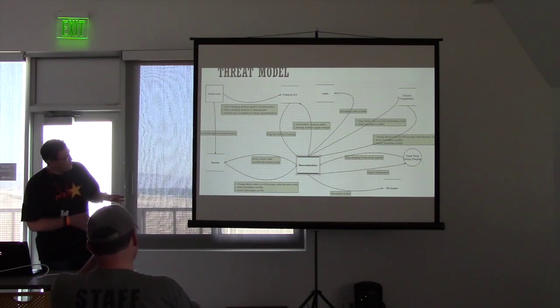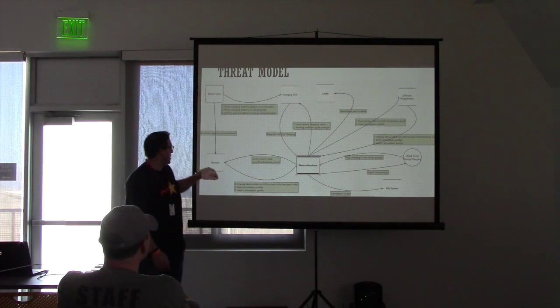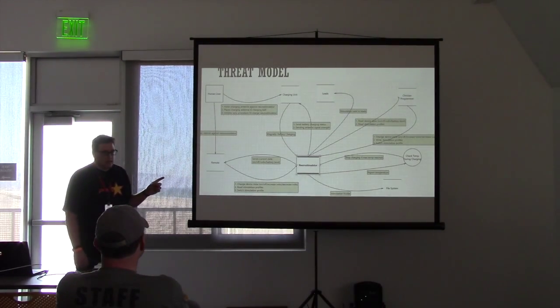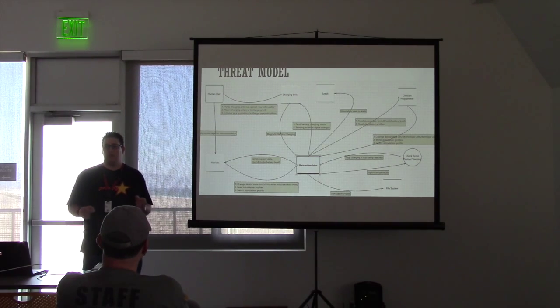A couple of the components here are kind of critical. The neurostimulator itself is the small device that was implanted in the back. You have a remote control, which is wireless communication on the 400 megahertz bandwidth. Interestingly enough, that remote has a range of less than half an inch. So in the cases where my wife's wearing a pair of jeans and a thin t-shirt, it will not work to turn it on or off.